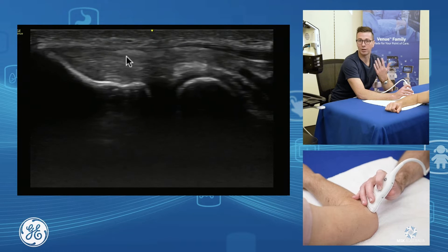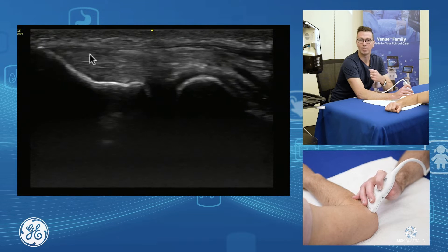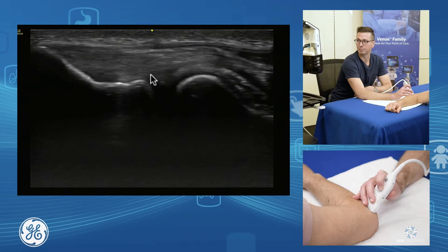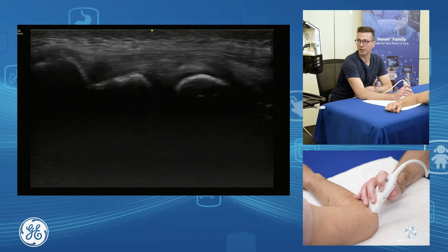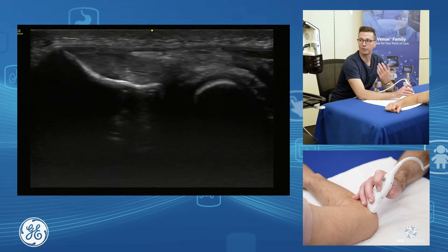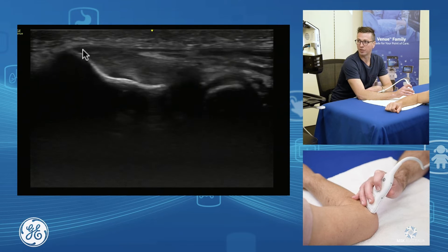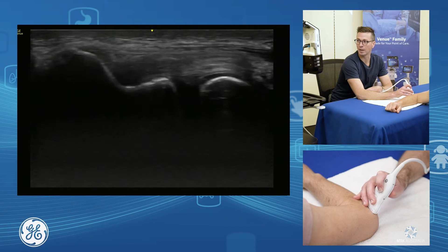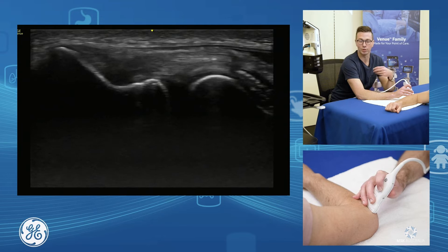The top layer is our extensor digitorum communis, the middle component is extensor carpi radialis brevis, and the deeper component is our radial collateral ligament. It's important to assess all the way through the bulk and have a look at the enthesis footplate. Where your tendon is going to fail is at the enthesis, so we assess the enthesis of all components — up into the main bulk of ECRB and down towards the radial collateral ligament.